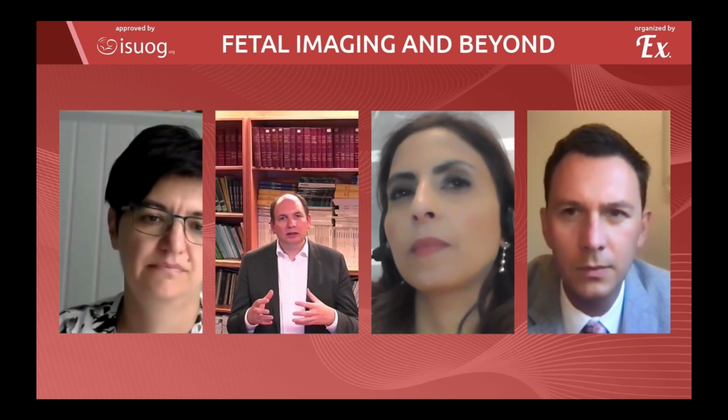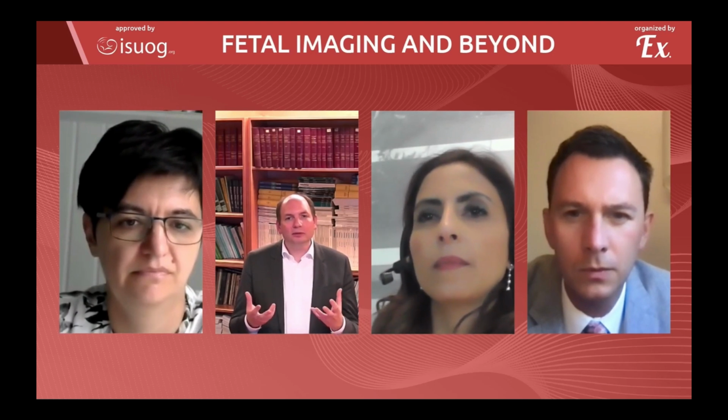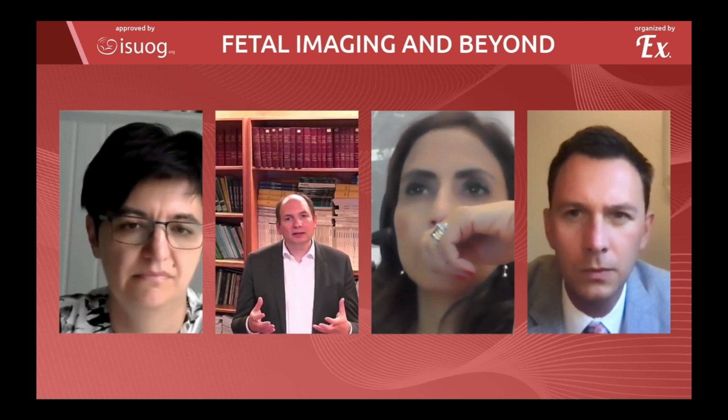Both a little bit. But I would also say that experience is the most important factor. You really need somebody who knows how to deal with fetal motion and adapt the sequences in a good way. I feel that the modern 3 Tesla machines with the better resolution now offer you even more details at the early time points. And the third reason is you also need to feel comfortable with looking at these early brains. In some countries, radiologists or people working on MRI are simply not seeing these early cases. They are used to the later ones, so they feel uncomfortable with the early ones, and that's something you need to take into account.